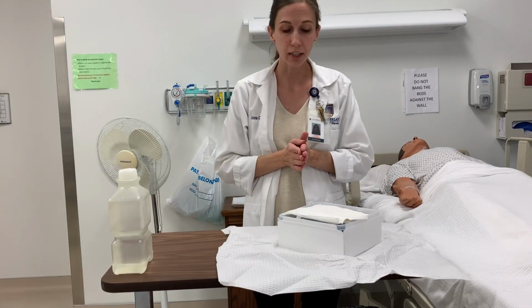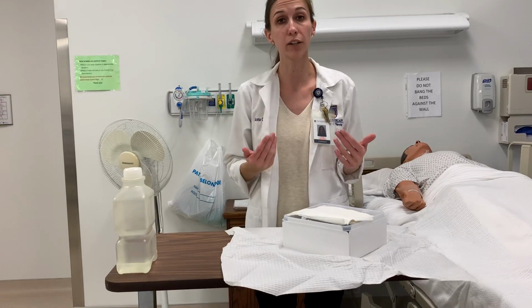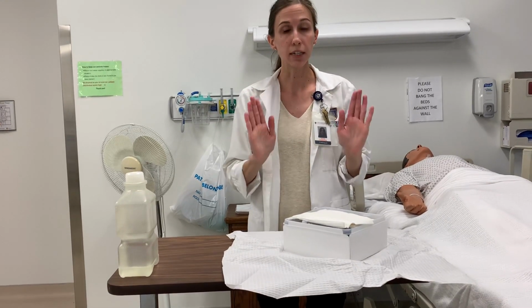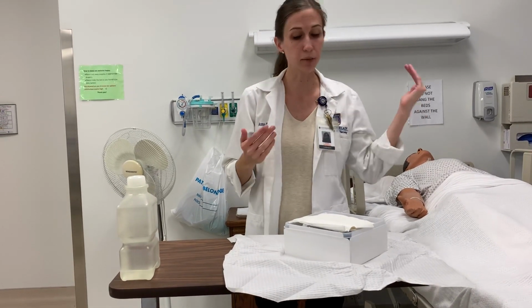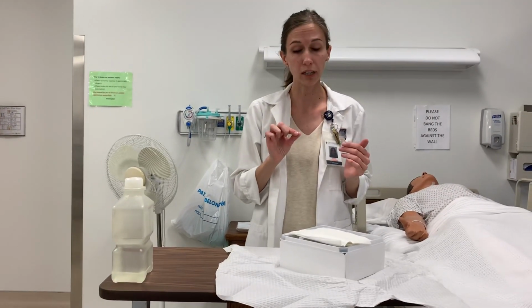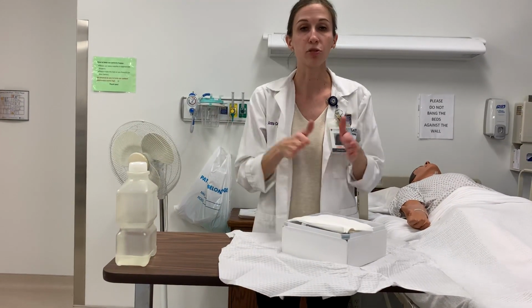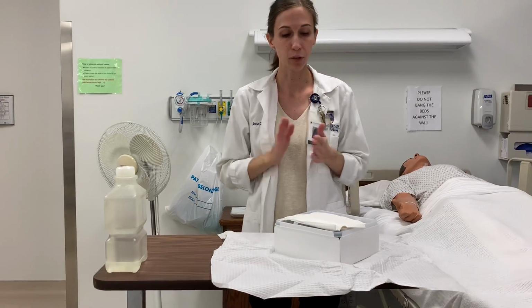In most of your kits, you may find gloves immediately on the top. So all I can do right now, when I just have my non-sterile hands, that I've sanitized, is grab out that pair of gloves, come over to the side, and apply those sterile gloves. With those sterile gloves now, I would be able to touch wherever I wanted within this kit, okay?